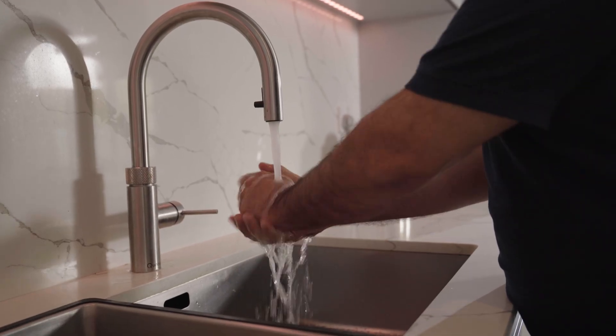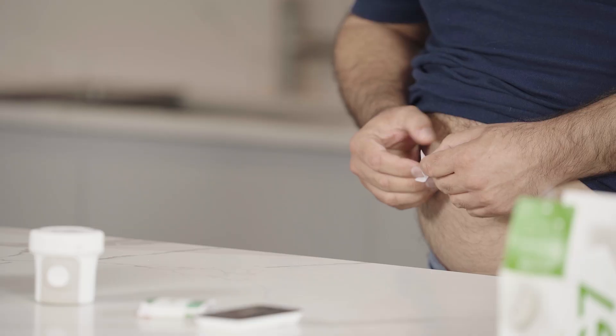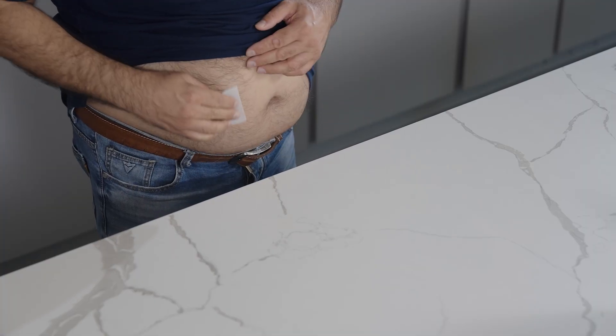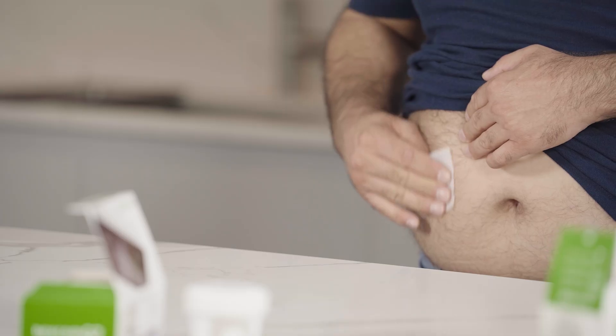Before you begin, wash and dry your hands. Then clean your site with an alcohol wipe and let it air dry for at least 10 seconds.